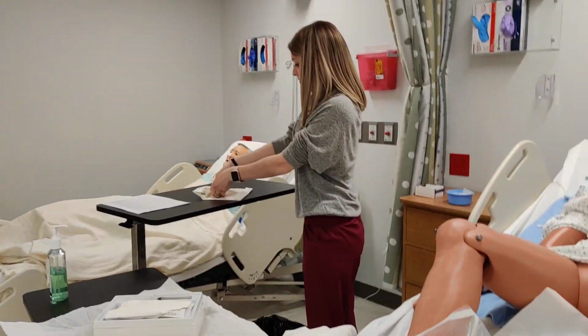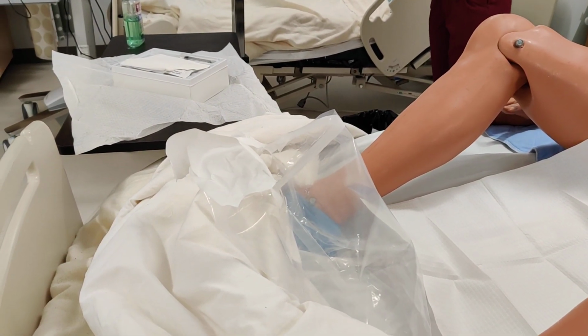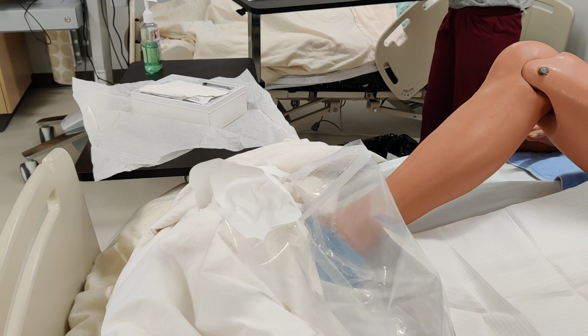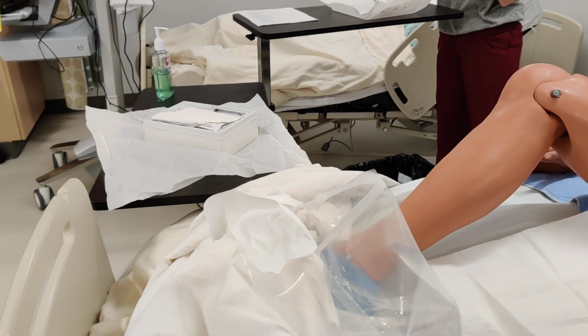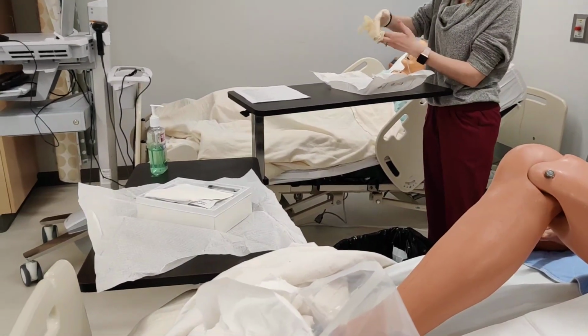Now, as she's donning those gloves, just to show you, she put the packaging for the Foley kit on the end of the bed and opened it up nicely. This can serve as a trash can for any of the supplies that she needs to throw out while she's sterile. That way she's not dropping her hand below her waist or turning her back to her field to throw things out.